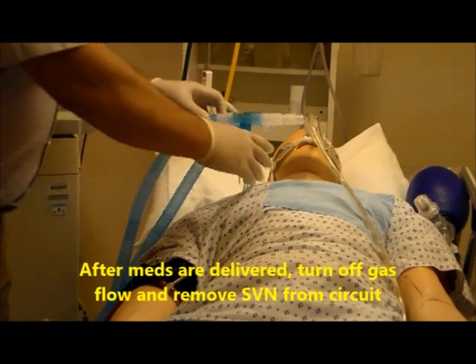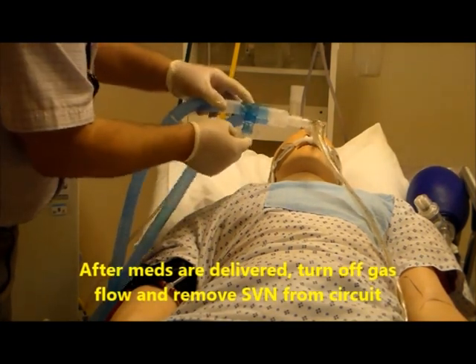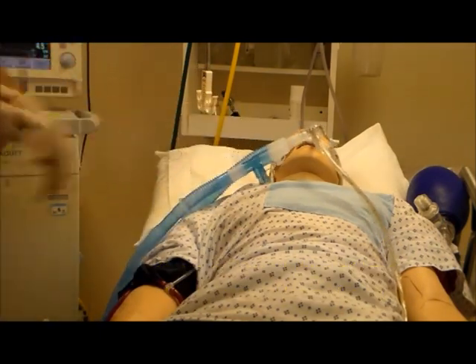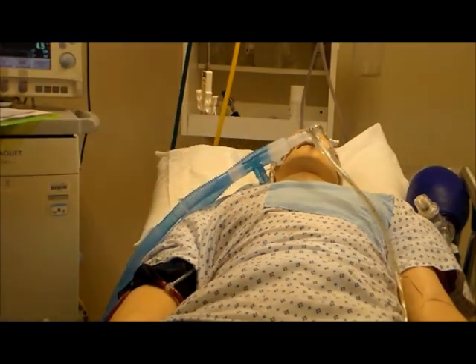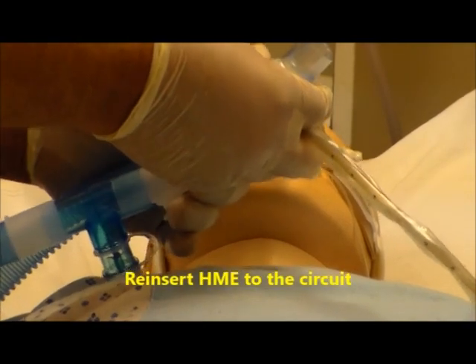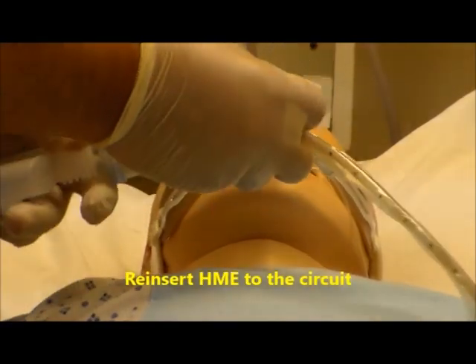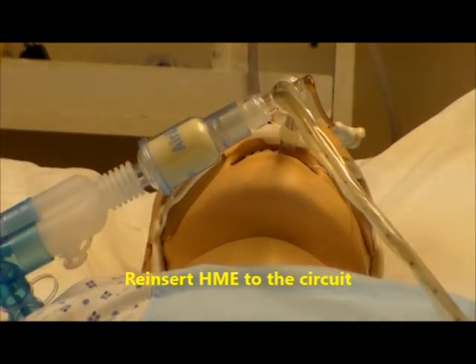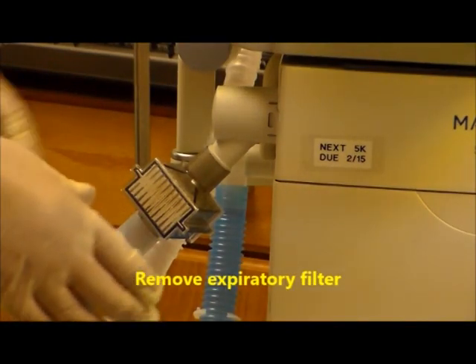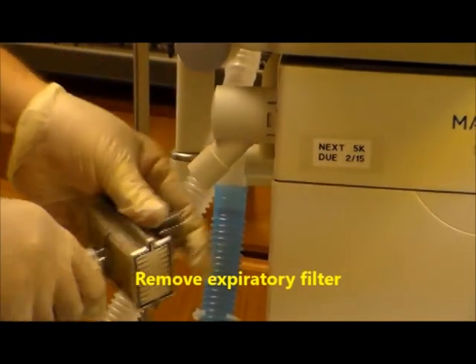After the dose is administered, turn off the flow to the nebulizer and remove it from the circuit. Then put the HME back in line, and finally take out your filter from the expiratory side of the vent circuit.